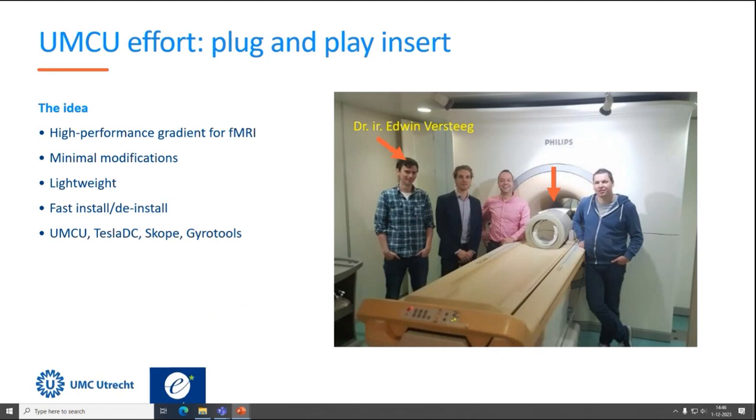So this is now talk about our effort. We want to make a plug and play insert, so not something that takes a weekend to get in there. So minimal modifications, lightweight, fast install, deinstall, but high performance gradient system. And at the beginning we thought about functional MRI.